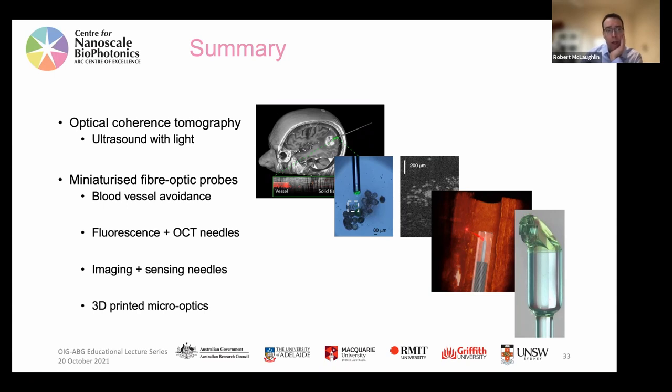The optics, because you 3D print things as a layered structure, those layered structures can cause little artifacts in the imaging, because in optics we like homogeneous materials that our light can go through. We don't like when things change. So if our fundamental part of 3D printing is to make little layers that we layer on top of each other, there's always a danger that there's some sort of inconsistency between those layers.